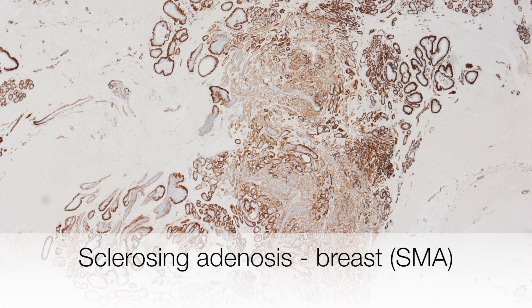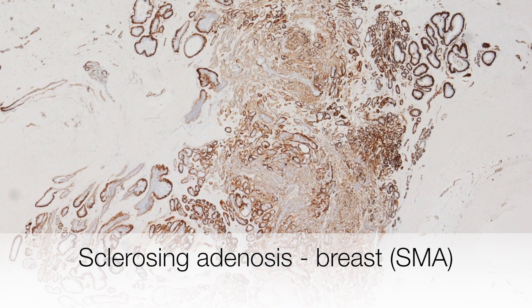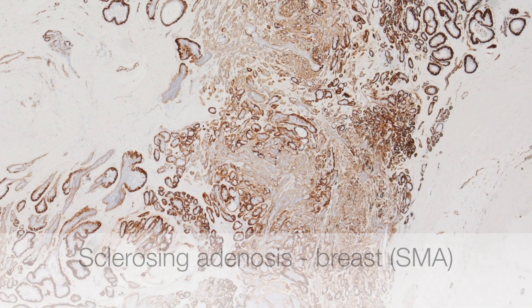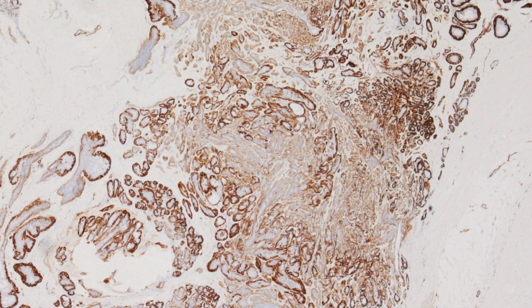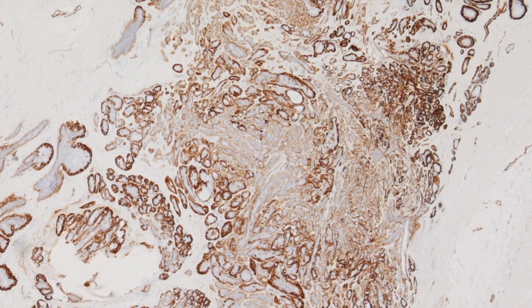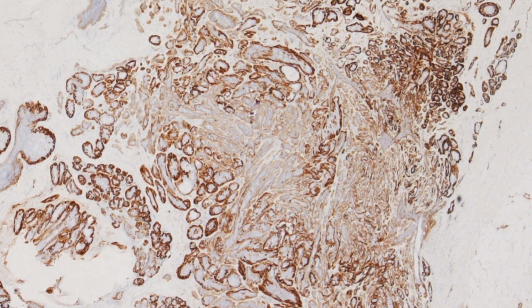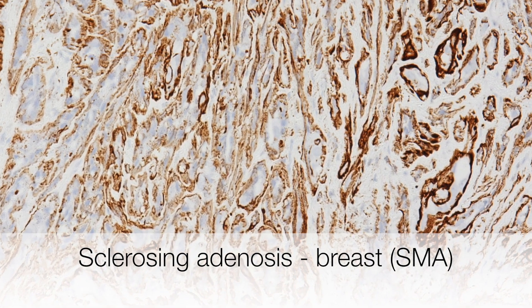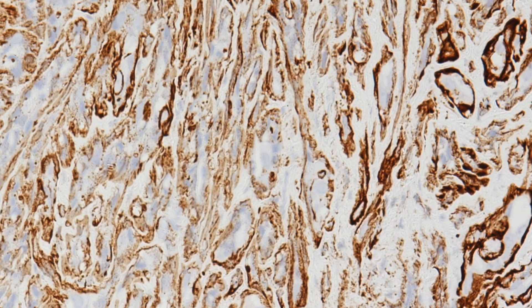The most useful stain for diagnosing sclerosing adenosis is smooth muscle actin. This is the stain for myoepithelial cells. The low-power view shows a browner appearance of the lesion in the central area because of the prominent component of myoepithelial cells centrally. This higher power view shows positive staining of myoepithelial cells for smooth muscle actin and negative staining of the luminal epithelial cells.